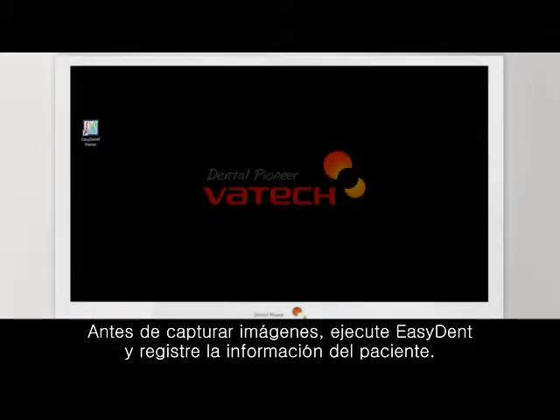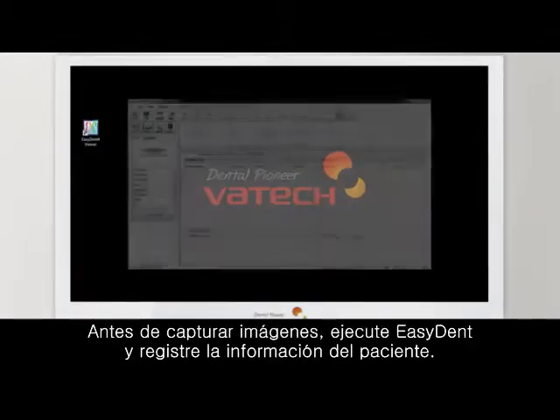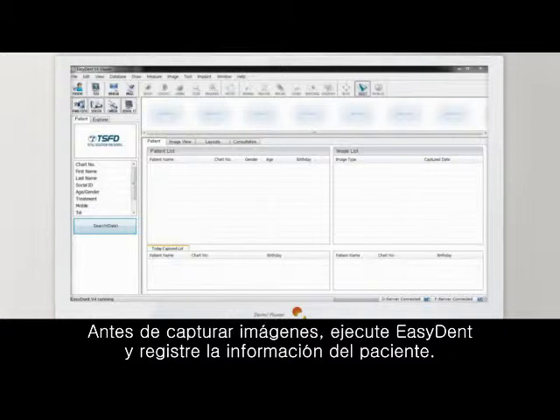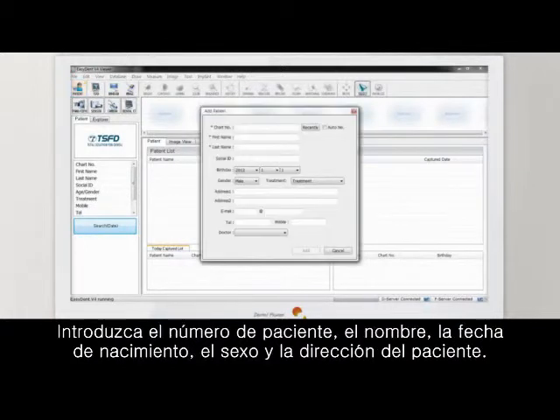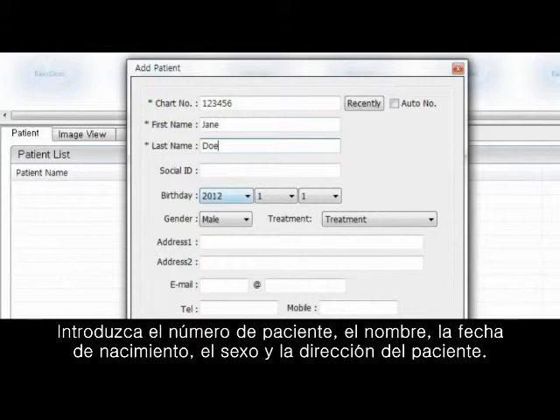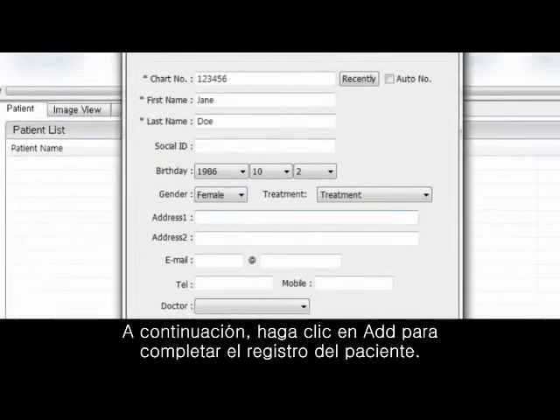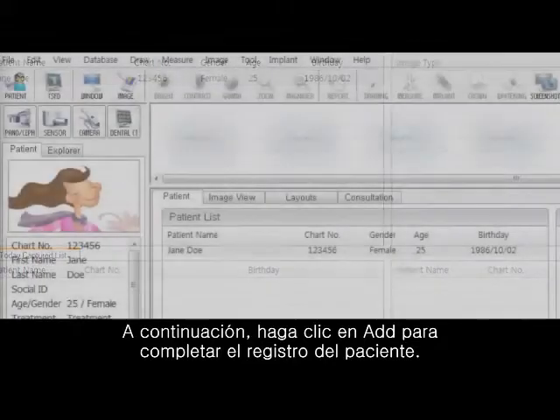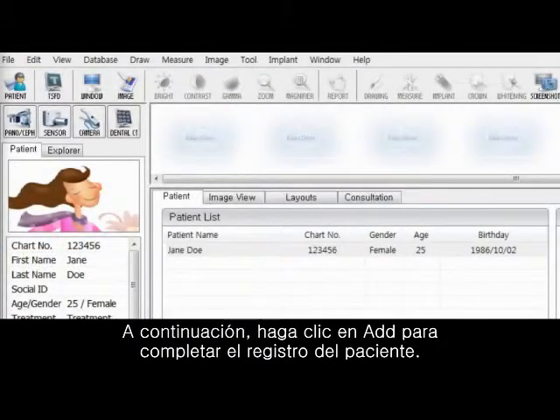Before image capturing, execute EZDENT and register the patient information. Enter chart number, name, date of birth, gender, and address of the patient. Then click ADD to complete patient registration.